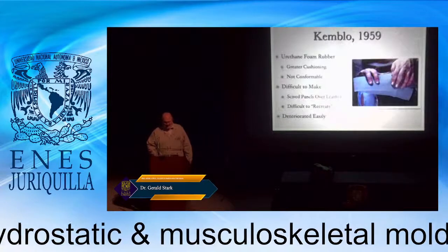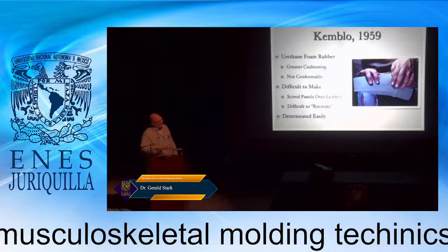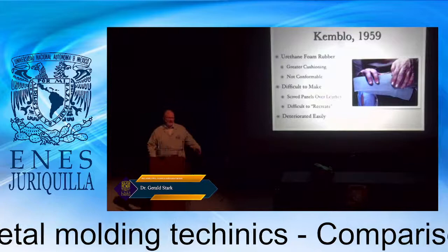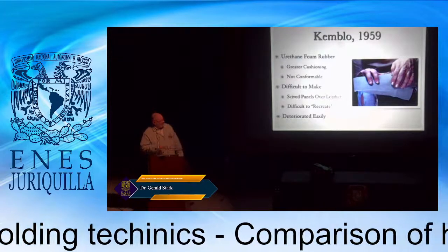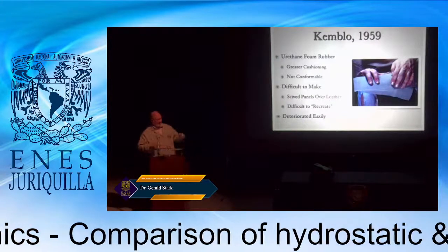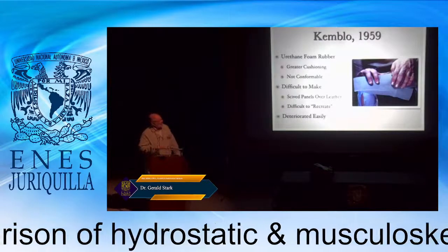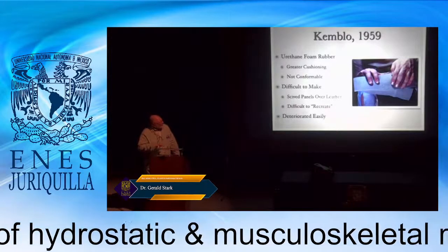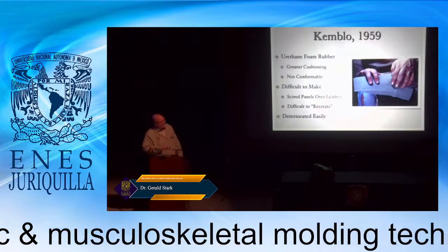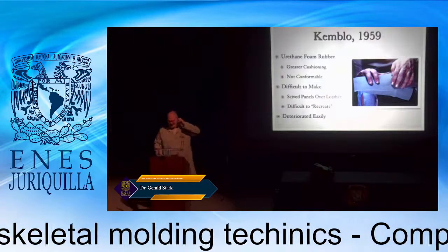One of the first soft materials used for sockets was in 1959, and it used foam rubber. It was really difficult to use because it was a thermoset, not a thermoplastic. A thermoset does not take on the shape of the patient's limb. In fact, it resists taking on any shape. A thermoset actually burns before it takes on any shape, where a thermoplastic will actually adapt to that and conform to that shape. But we used to use this foam rubber in combination with leather to make a very conformable system, but you had to skive panels all the way around the limb.